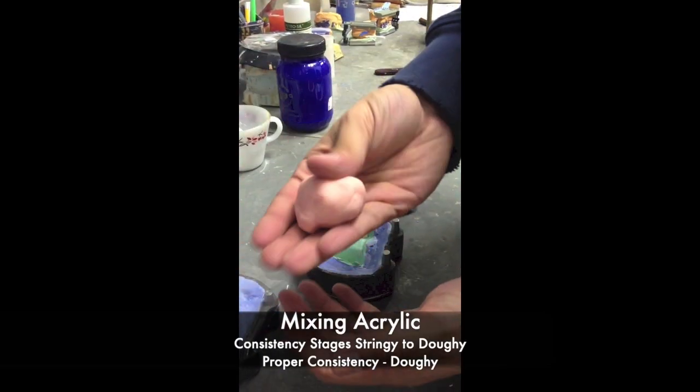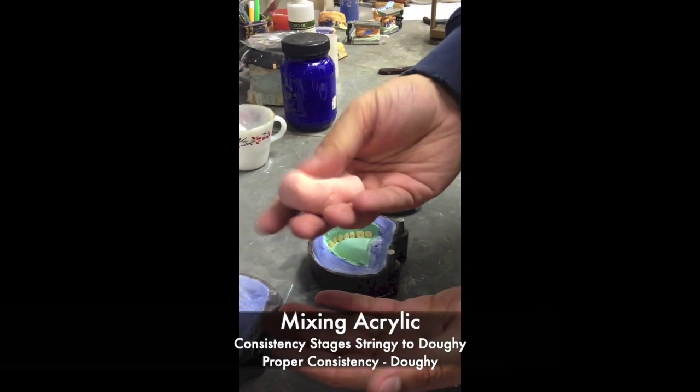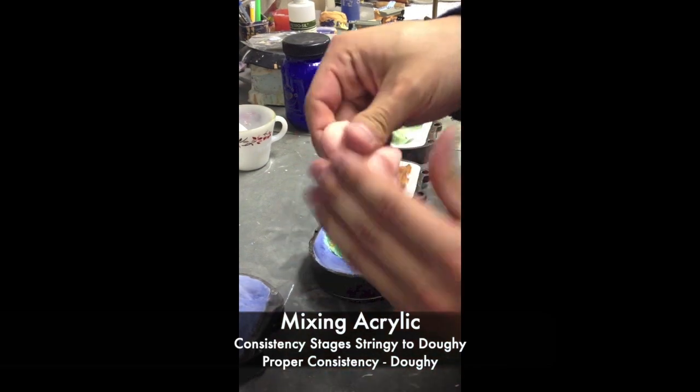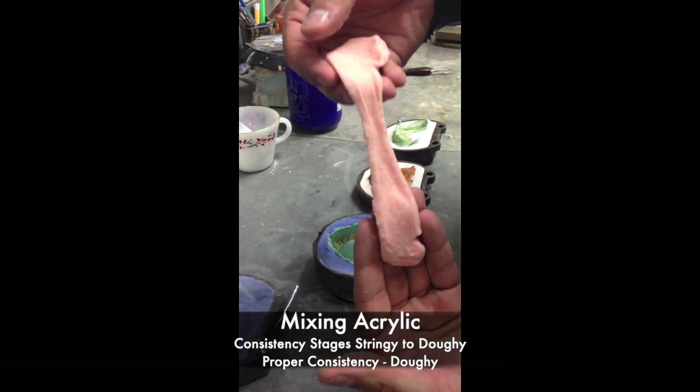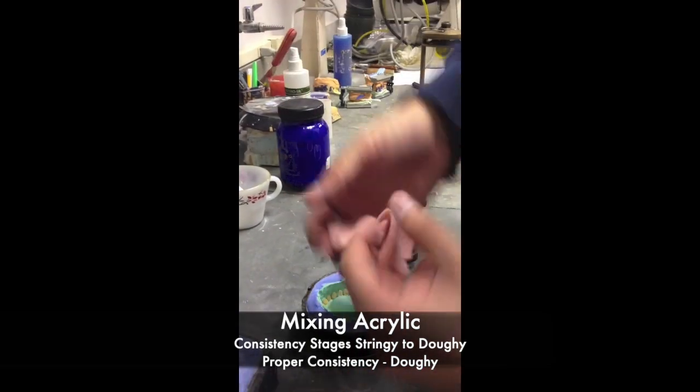While the tinfoil is drying, you may mix your acrylic. Remember to wait for the acrylic to go through its consistency stages — from liquid to stringy to doughy. Once it reaches the doughy consistency, it is ready to be packed.